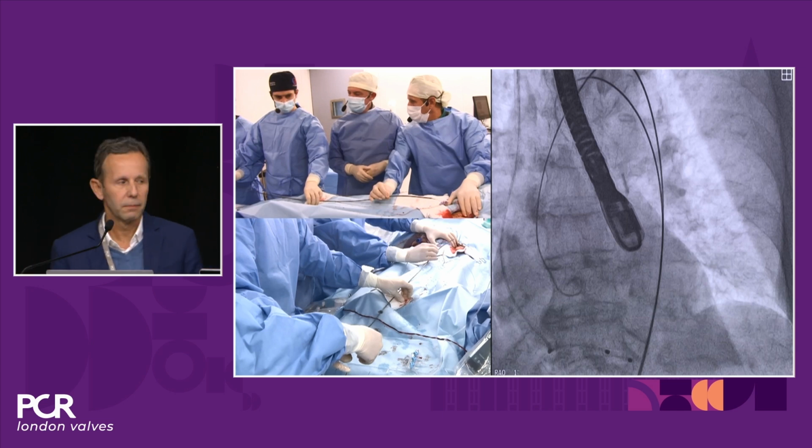Yes, there's somebody from the audience, Tamim, that is asking about potential brachial access for this device, Fabio, using sometimes even radial 8 French, or brachial. I don't think this is designed for brachial at all. Remember, the design of the filter goes up to the descending aorta, so I think brachial is totally excluded as a hypothesis for this solution.